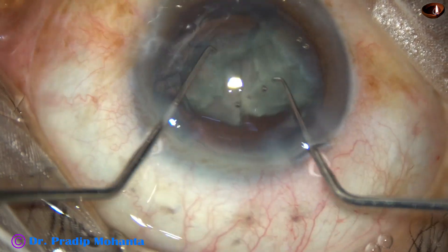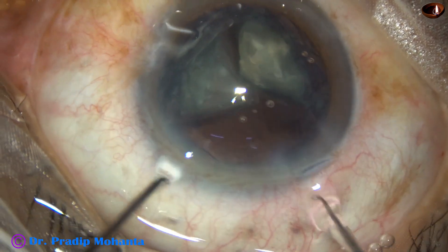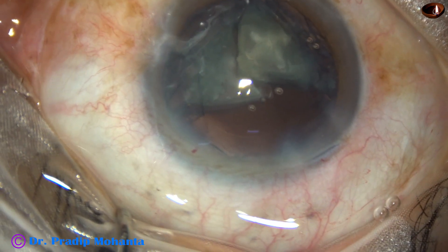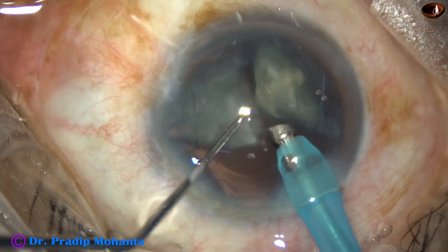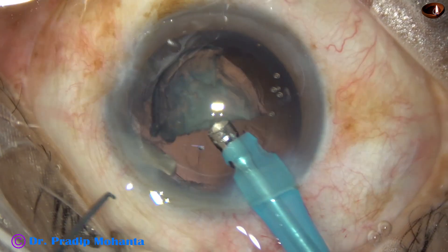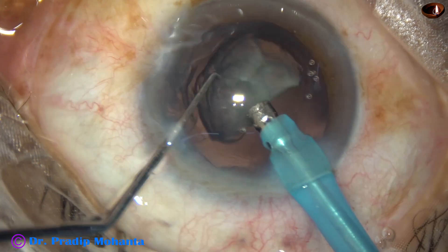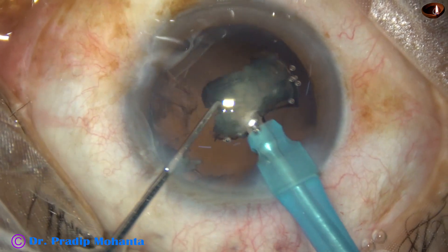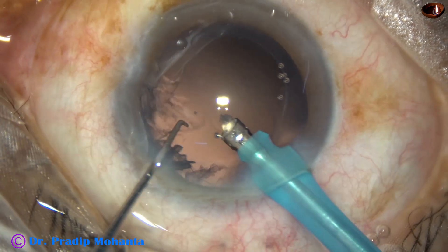We can easily place the other two pieces. Inject visco and using two instruments, we can bring the pieces out of the capsular bag — just lift up the apical portion of the triangular pieces from the capsular bag. And now, take one piece and emulsify. Smaller pieces should be removed first because they go here and there and hit the corneal endothelium. At this time, the vacuum is reduced to 200 and flow rate to 20, and the last bead of the nucleus is removed.